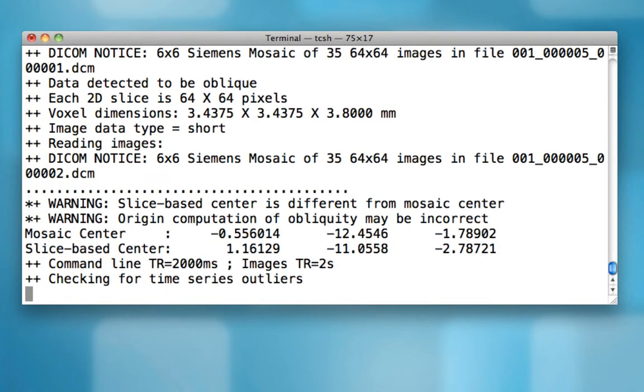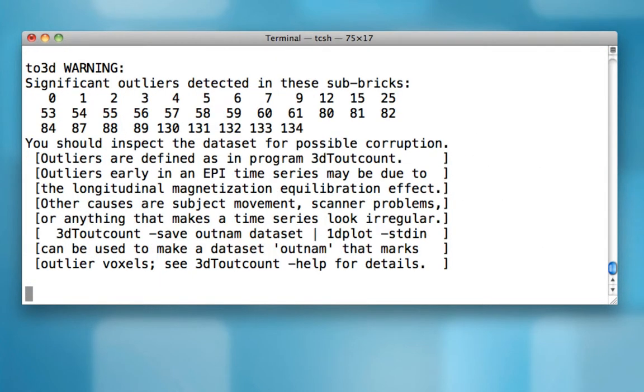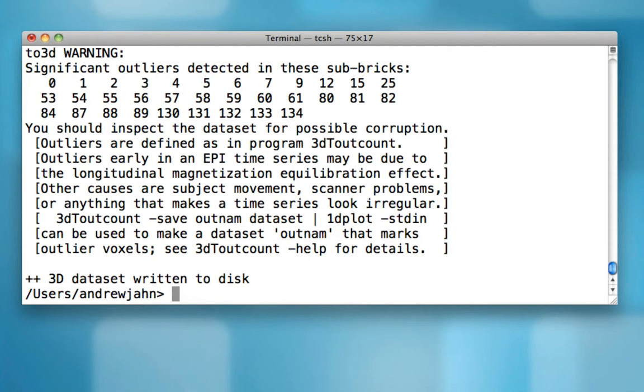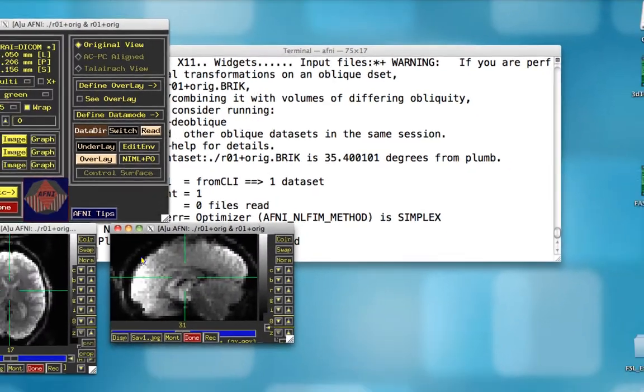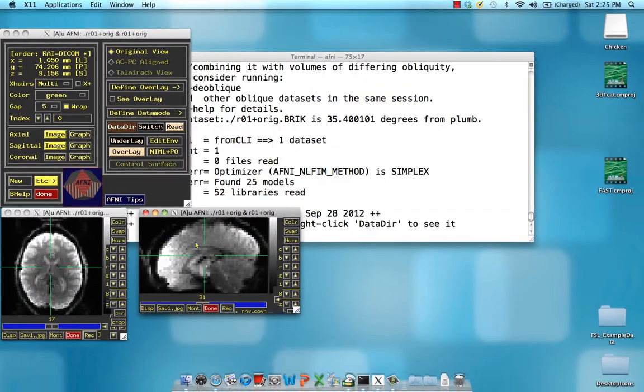I'll go ahead, hit enter. And as you can see, it does the conversion in a very quick amount of time. Now, first thing we should do is open up this R01+orig data set to see whether it did an okay job.